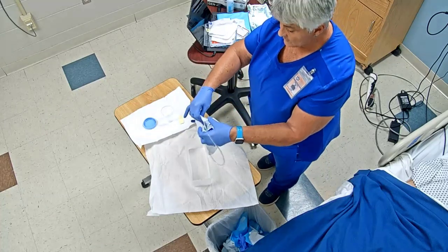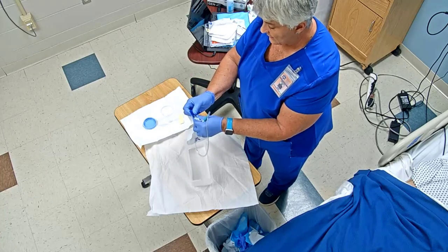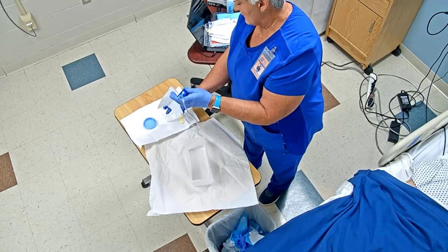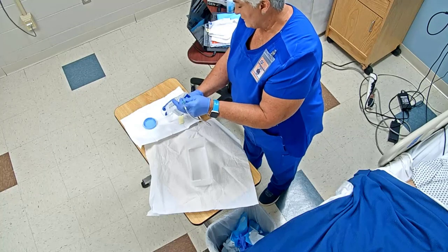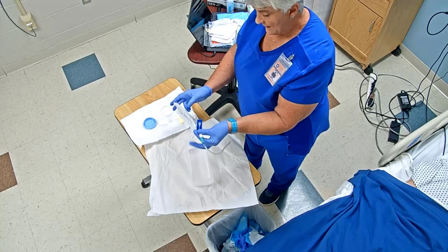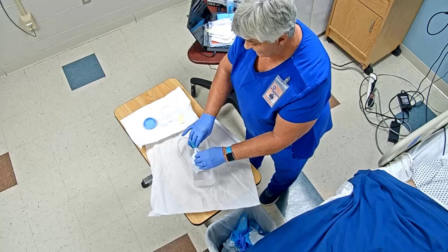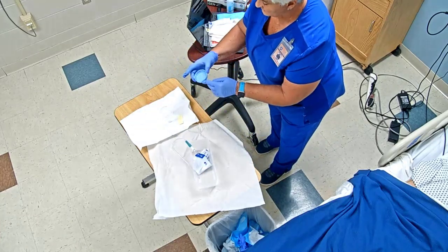And so I've got it clamped right now, so without touching that, I'm going to go ahead and undo it, and then I'm going to put it over my cup, and then unclamp it. We're going to get however much we need, which is typically about 30 mils, okay? Once I've clamped it again here, I'm going to lock it, okay? I'm going to put that back in here. I'm going to get my lid without crossing over.